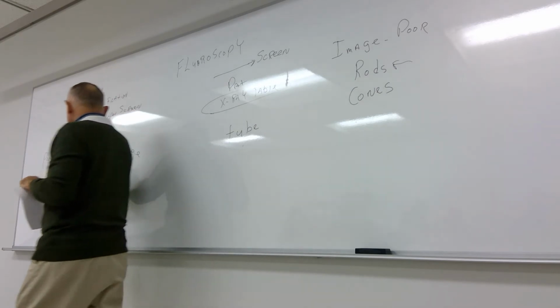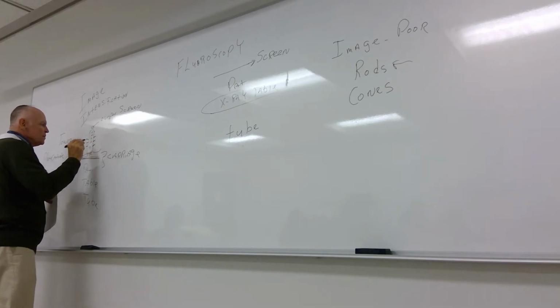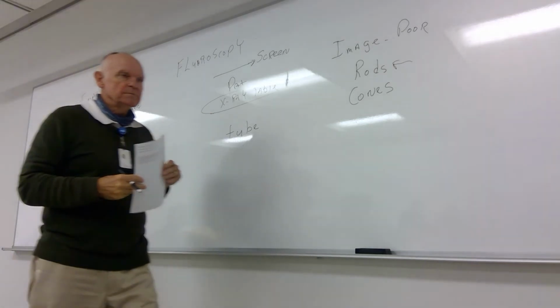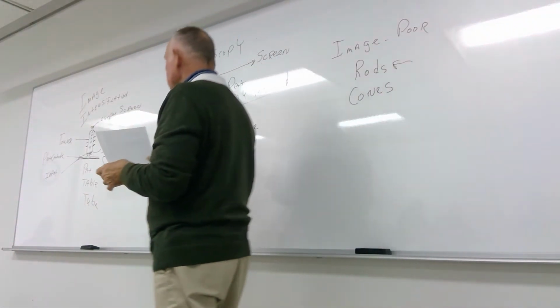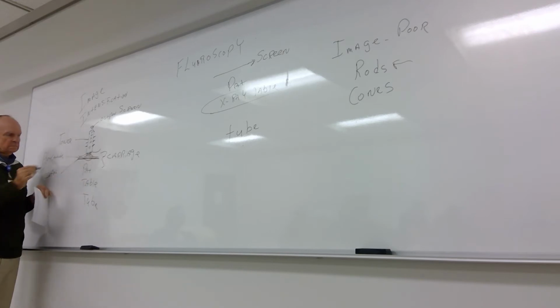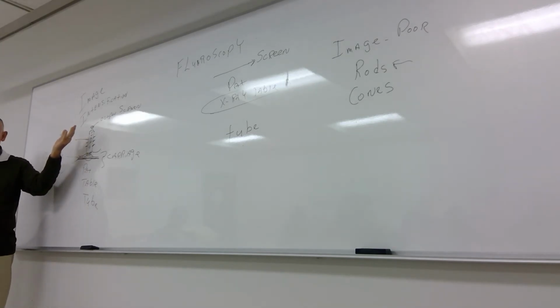Those electrons are shooting up the tower, and you see how it kind of gets smaller. The dimension of the input screen will be like that, and this would be circular. Those electrons hit the output screen and give off what?